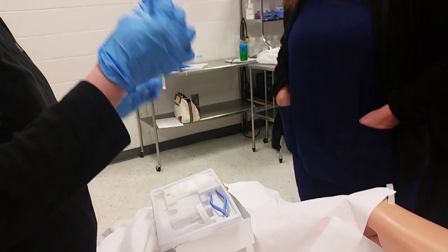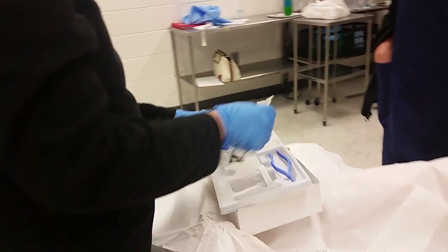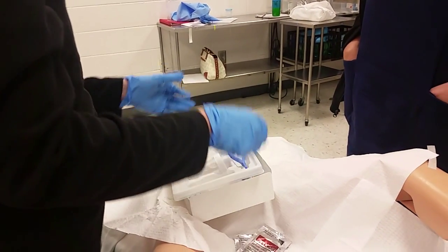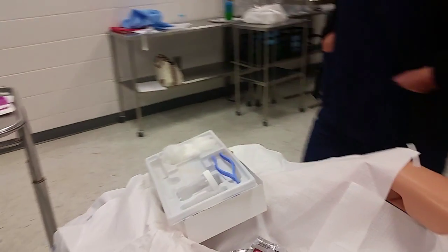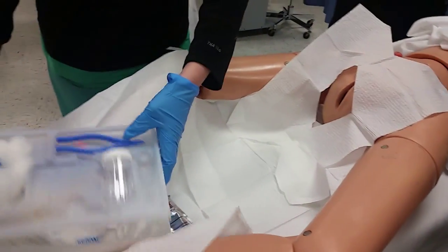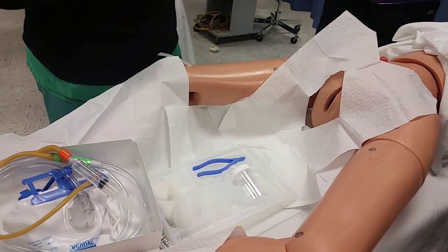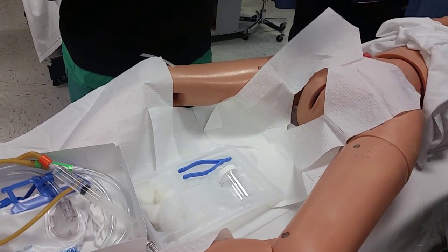You will either have betadine or it will be cotton balls in your pack. This is the whole pack of it — you pull it out. You can separate these before you do that if you want. I like to sit this here at the one-inch mark.